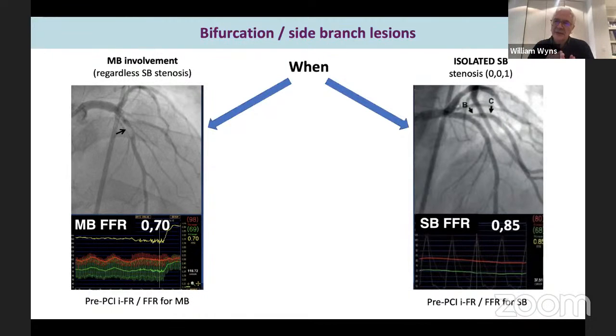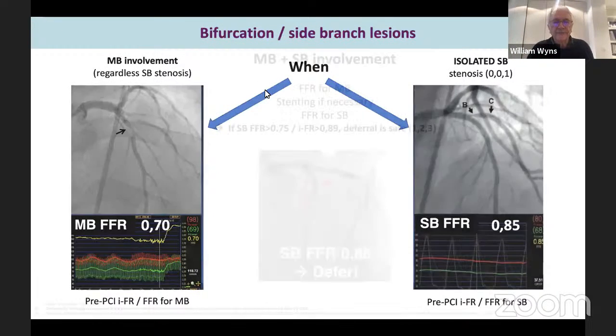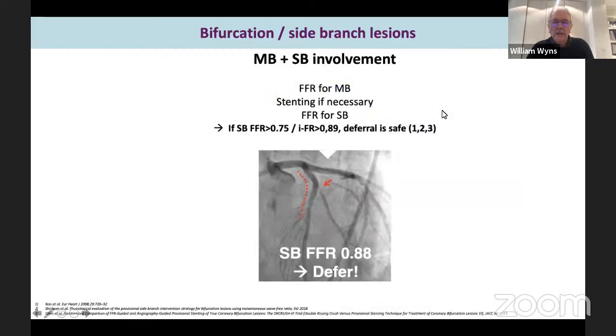The bifurcation angle here is around 45 degrees, something like that. With these low bifurcation angles, you have a more and more elliptical ostium of the side branch. While if you have a 90-degree side branch, then it will be more round, and this effect will not be apparent. So don't be fooled by angiography. Combine both. This case is one more complicated, Mattia, where you have both involved, or it's another example where you can use the FFR and the side branch to decide whether or not something needs to be done about this apparent ostial stenosis. Right.